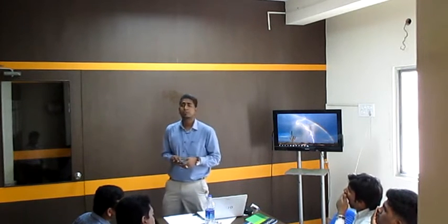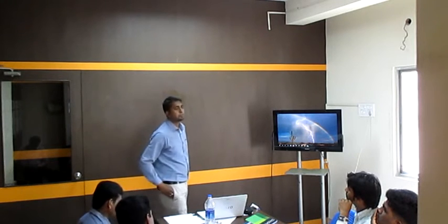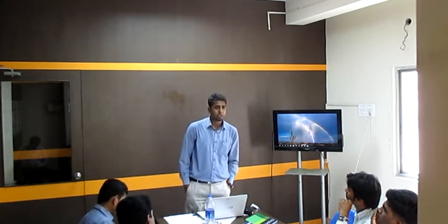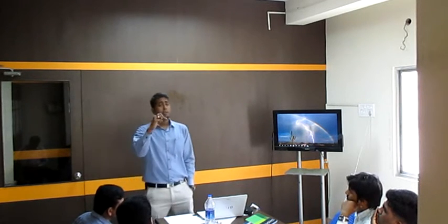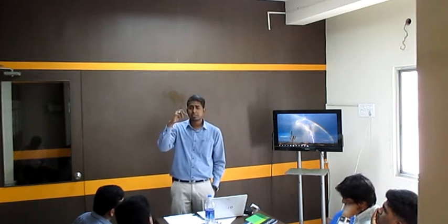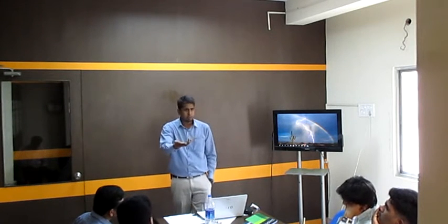Okay, in bone surgery units we require 20:1. In case of your endomotors we require 20:1 and it is represented by green color. So if you are not able to remember this blue, red and green, by the time you will be able to remember it, no issues.